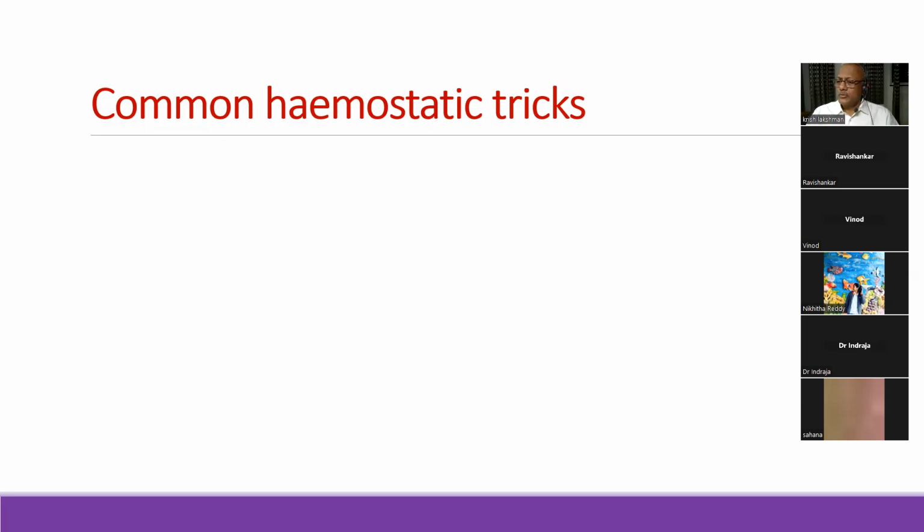The only time you disturb the pressure is if you find blood oozing all around the place where you have put the pressure, which is very, very rare. So if you have achieved relatively good hemostasis, put pressure there and that's all you have to do. Okay, pressure is one of them. What else can you use? Use energy sources. Yes, sir. We can use energy sources. Okay. What else?